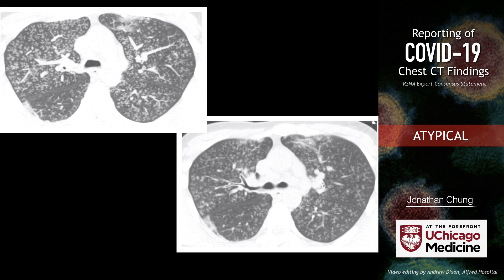Another example of tree-in-bud opacities — just to make sure you understand what tree-in-bud looks like. Tree-in-bud nodules are a subset of centrilobular nodularity, and by definition they should give you relative subpleural sparing. You can see how these nodules don't actually extend to the lung periphery. The nodules themselves give you nearly complete subpleural sparing, because tree-in-bud nodules are a subset of centrilobular nodularity, which by definition should spare the lung periphery.